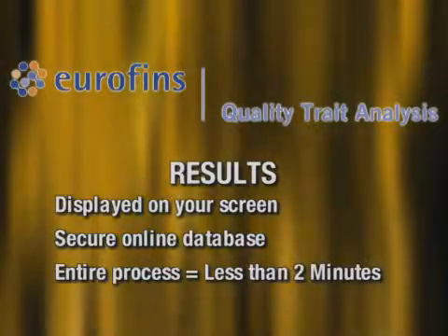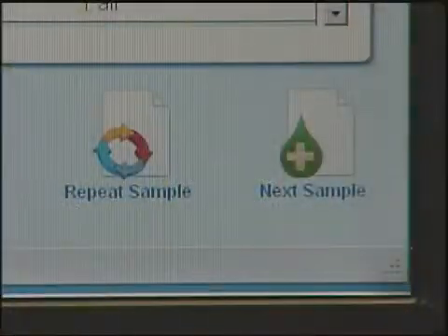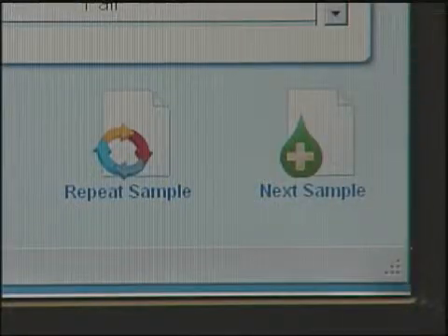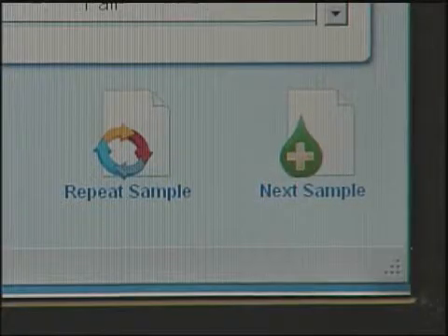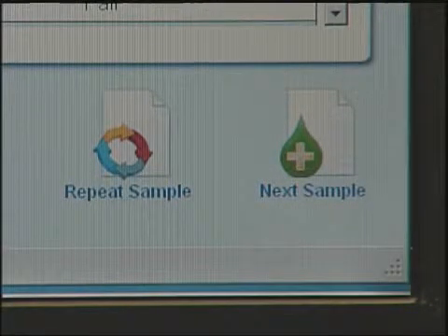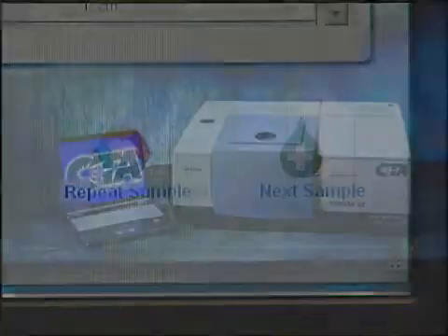The entire process takes less than two minutes. If you have more samples to test, click Next Sample and start again.